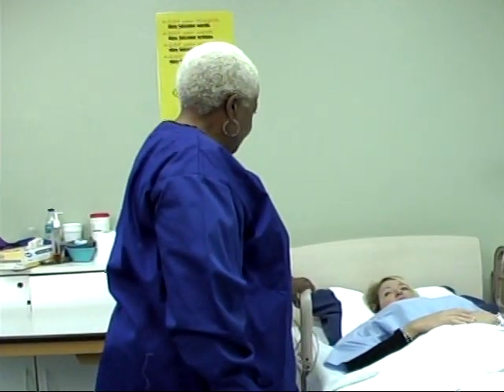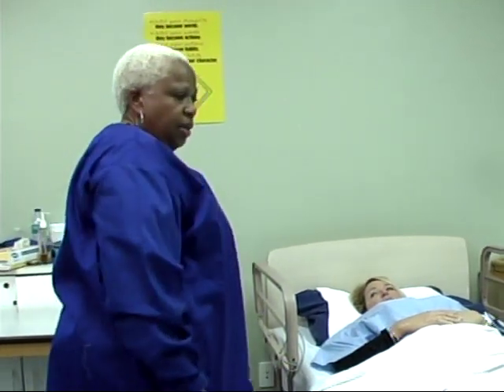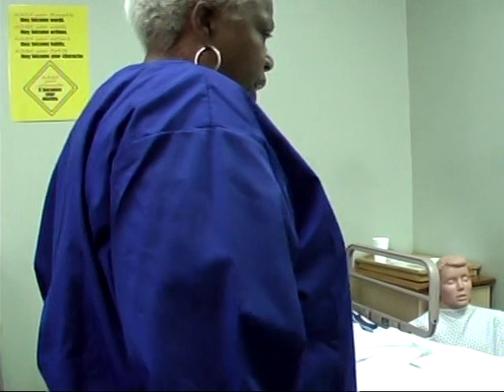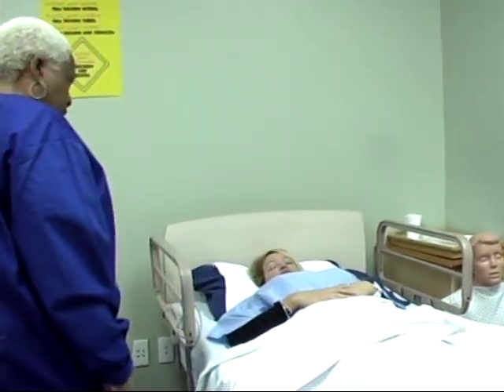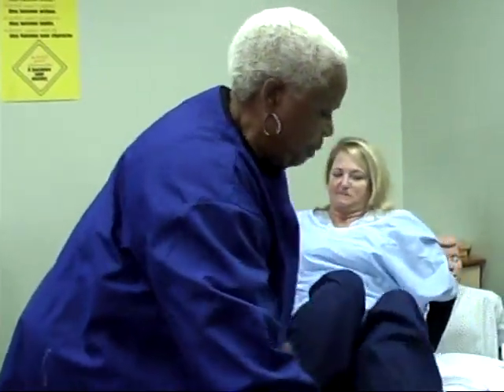Good morning. Hello. I'm going to get your blood pressure this morning, okay? Okay. I'm going to pull up and lock her bed. Do you feel like sitting up on the side of the bed for me? Yes, ma'am. Okay, good. Sit up on the side of the bed for me.